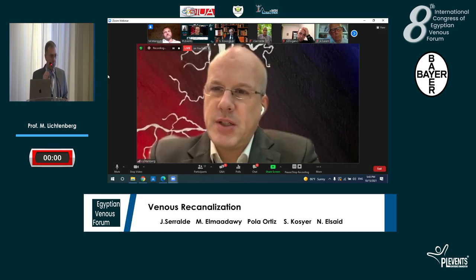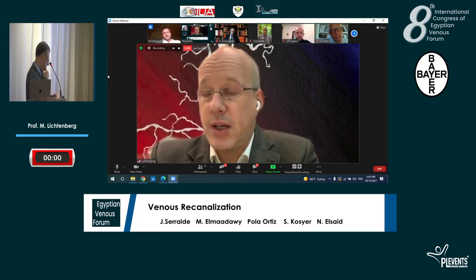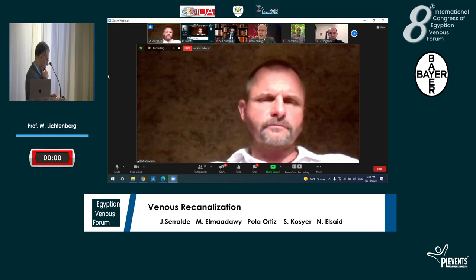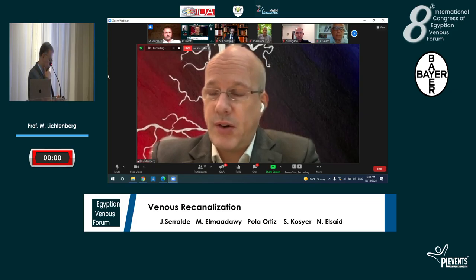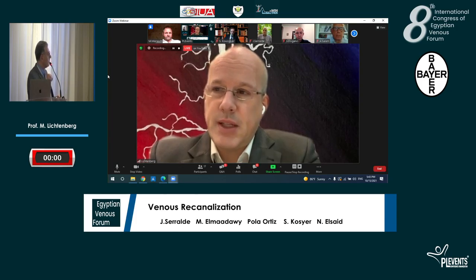Yeah, that's a good question. We sometimes see, or we could say quite often we see, patients with pelvic venous disorders who have an ovarian reflux and a significant outflow obstruction. And here it's definitely difficult to really assess what is the major problem. Is it the ovarian reflux, or is it the outflow obstruction? I personally believe that the obstruction is the driving factor, but I think it is very individual to the patient. So whenever I do these cases, I analyze the ovarian veins in terms of reflux and the May-Thurner point with IVUS, and then decide very individually which I'm going to treat first, probably the outflow obstruction first.